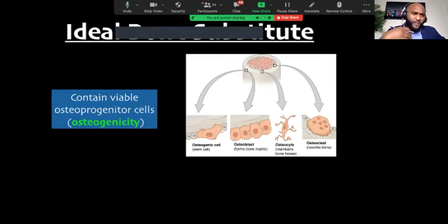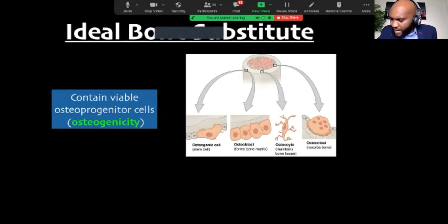Of course, with very tiny implants, you would. But again, if you're talking about 2 millimeters only of bone, yet we said we require 1 to 2 millimeters, it's actually now a strong 2 millimeters of bone all around your implant.